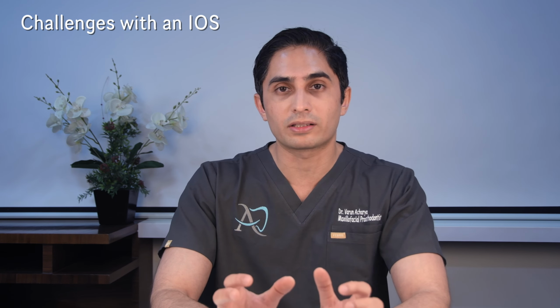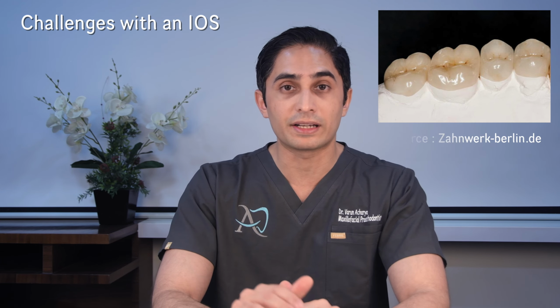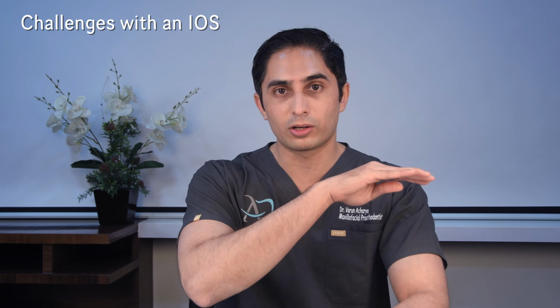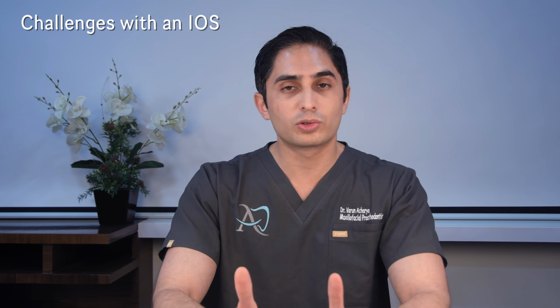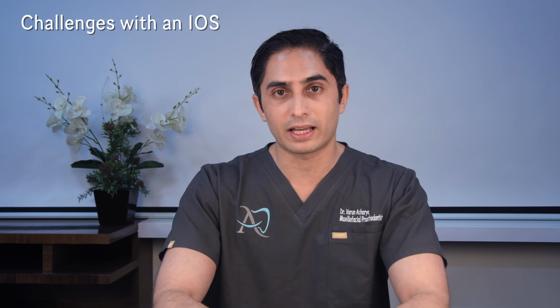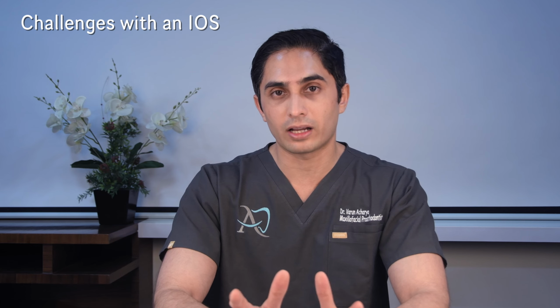Now, if you're talking about inlays and onlays as your tabletop preps, specifically onlays, not inlays, where there's no geometry at all, where the occlusion is just lopped off and you're sticking on a piece of lithium disilicate, for example, those would be fine with the scanner because the geometry is not really complex for the scanner. However, I don't do those types of preps. I think they're very aggressive and very unnecessary, but that's a discussion for a different time.